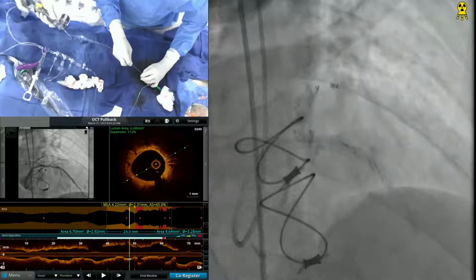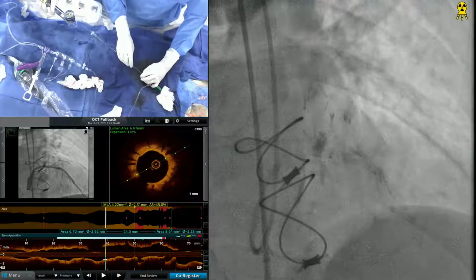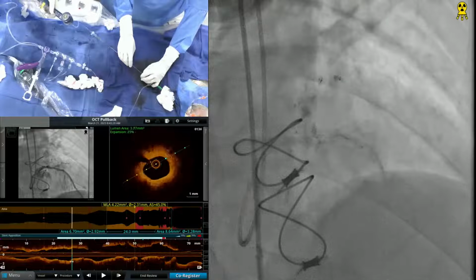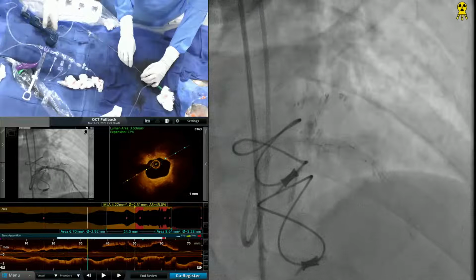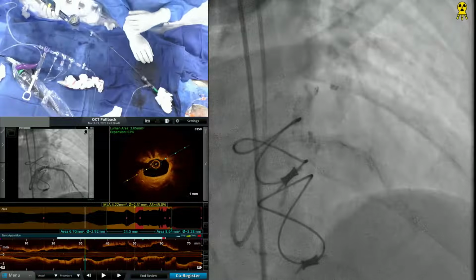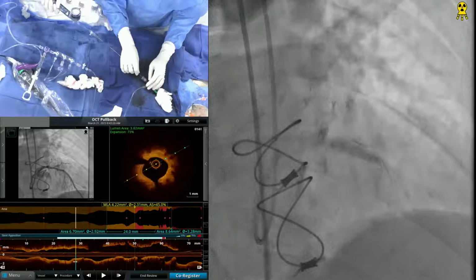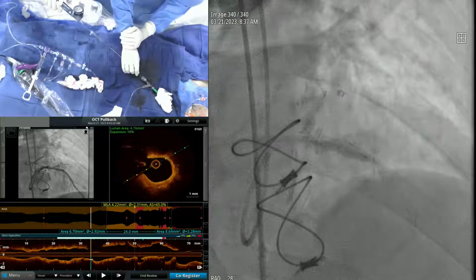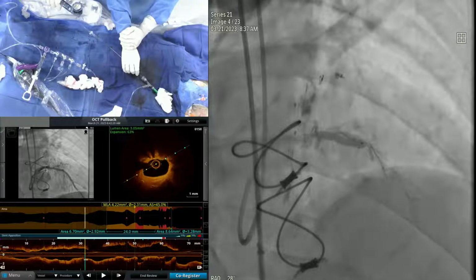Anu, are you planning to do something on the more distal segment after the large septal there? I mean, no plan. Okay. Did OCT cover all that? Yeah, just show with the OCT. Is there any lesion there in the distal? Yeah, actually here's also some ISR lesion. The area is around 3.5, but not super tight, the distal part.